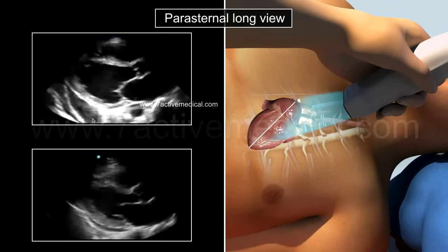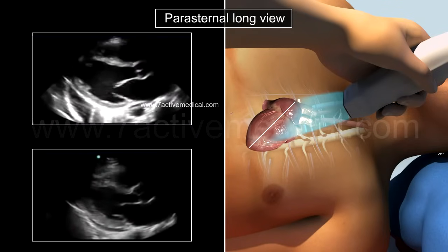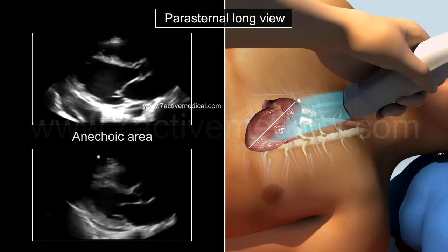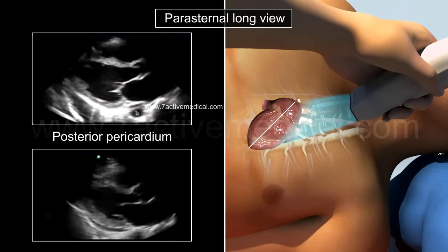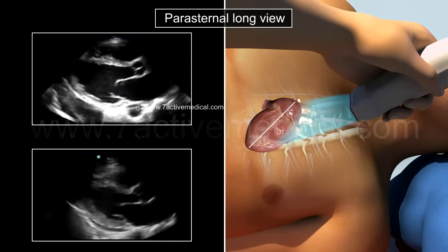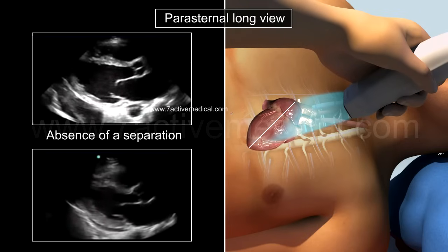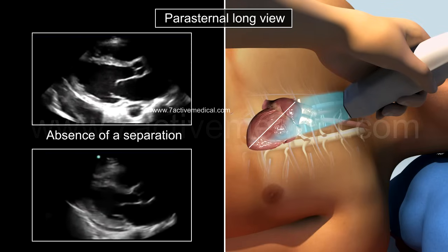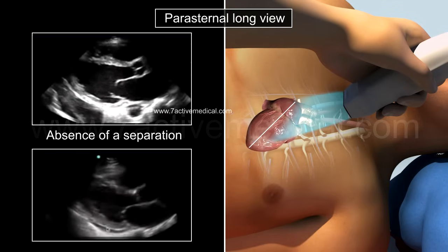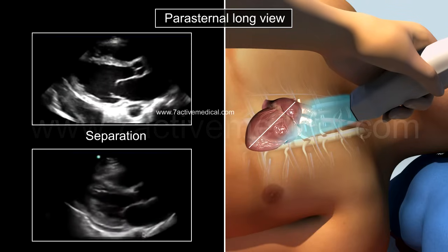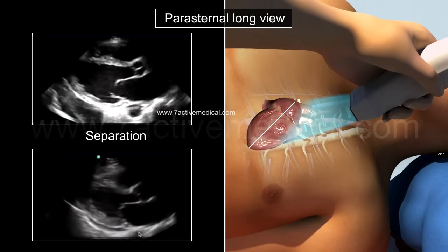A pleural or pericardial effusion is identified by an anechoic area in the region of the posterior pericardium and the descending aorta. Absence of a separation between the posterior pericardium and the descending aorta indicates a pleural effusion, while the presence of a separation between the two indicates a pericardial effusion.